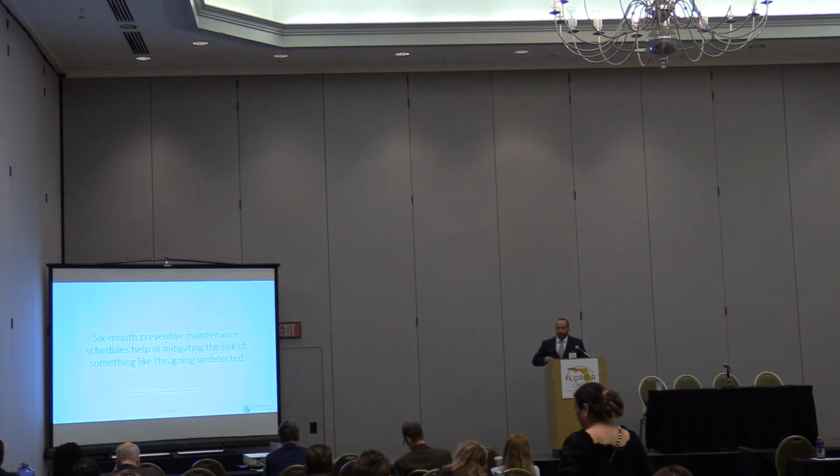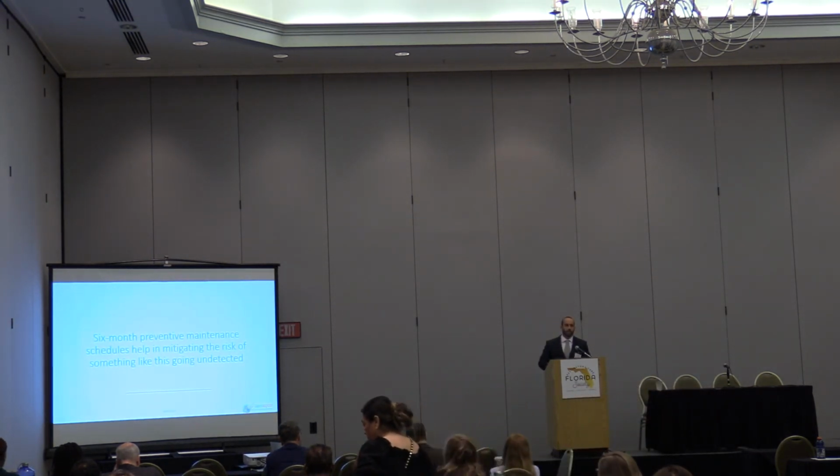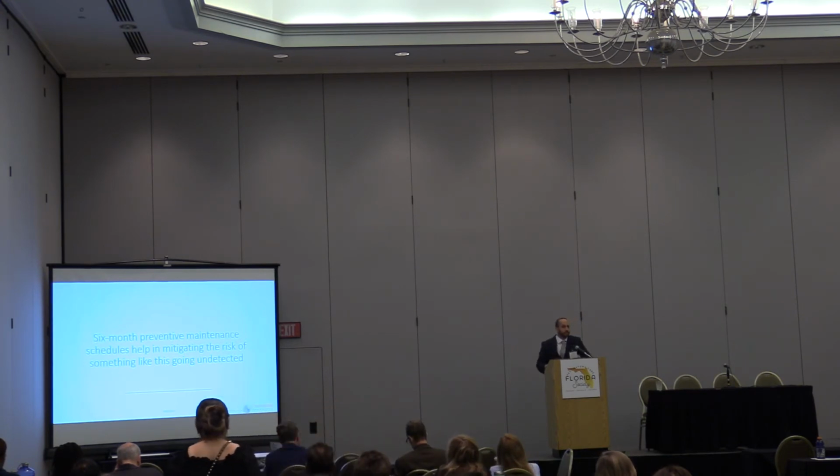So that underlines the importance of a consistent preventative maintenance schedule. For example, if you're following a yearly preventative maintenance schedule, and say for whatever reason it gets missed, we're all human. It's possible that the technician just fails to change it or doesn't notice it, and the unit passes everything else. It gets put back on the floor, and now think, between this 1 and 2 year lifespan, how many patients could be put at risk for something that, if it was on a 6-month preventive maintenance schedule, could be picked up a little bit sooner, or at the onset of while this failure is actually happening.